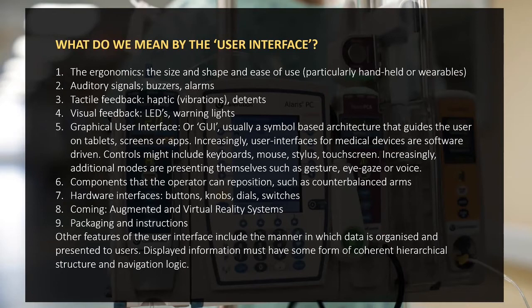So it's always a combination of things working together. We're not usually designing a device which has just got a graphical user interface. Quite often there's a combination of things which the user has to operate. So you've got to harmonize all of that and get it all working properly.